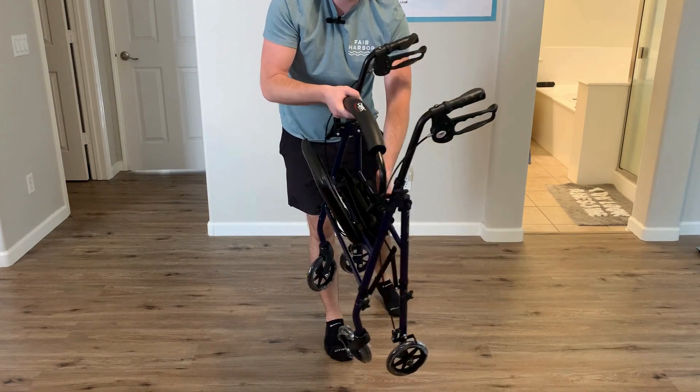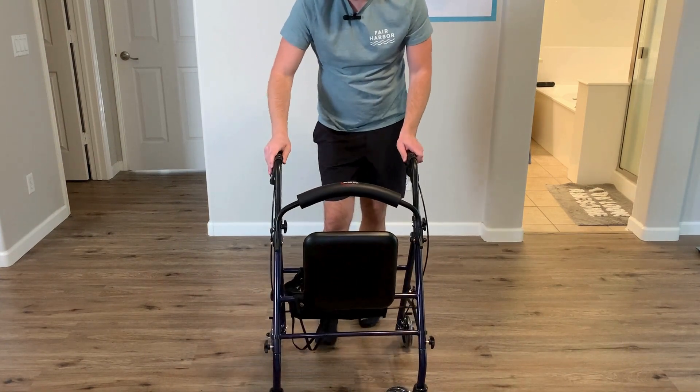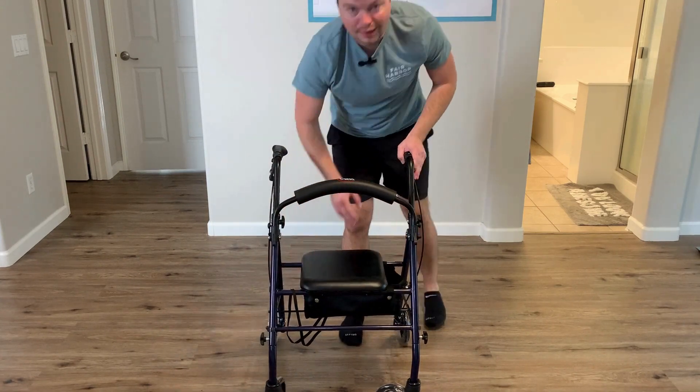You can throw it into your trunk and do whatever you need to do with it. Whenever you get to your destination, you can just set it down — it'll basically expand for you and you're ready to get on the move and get going.